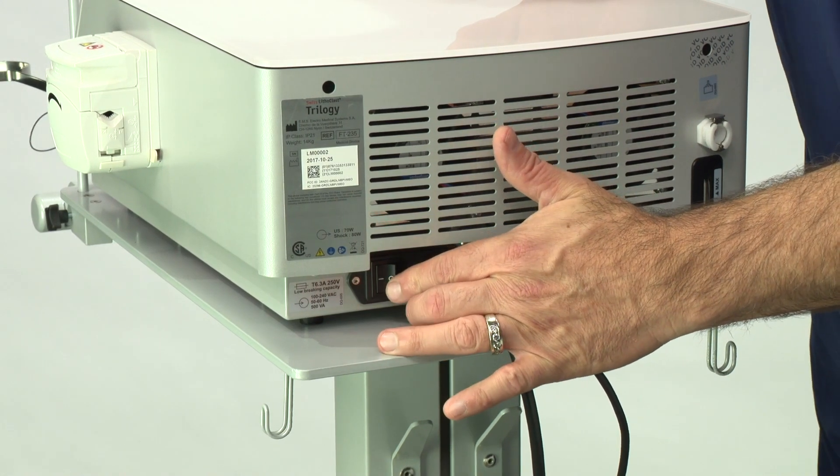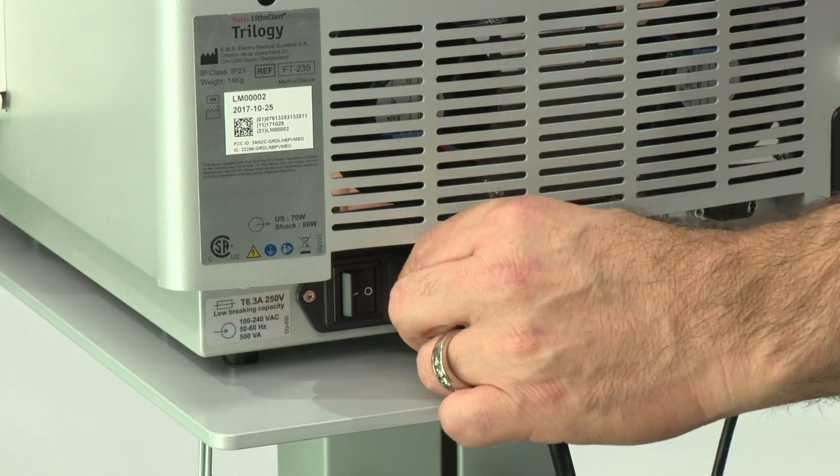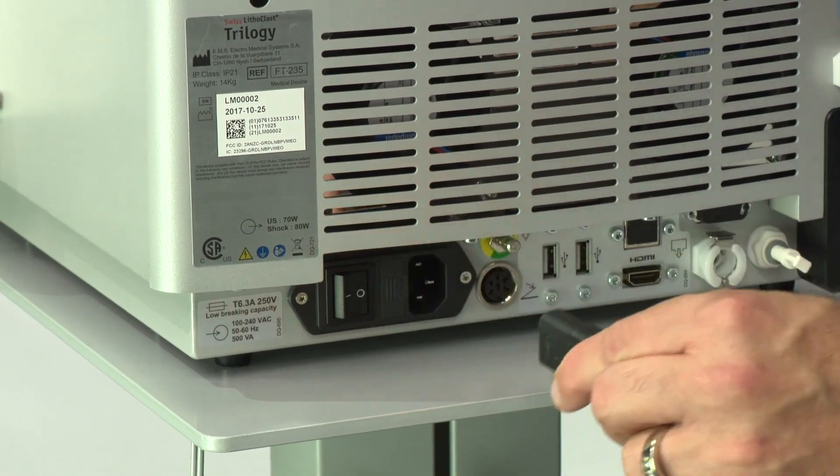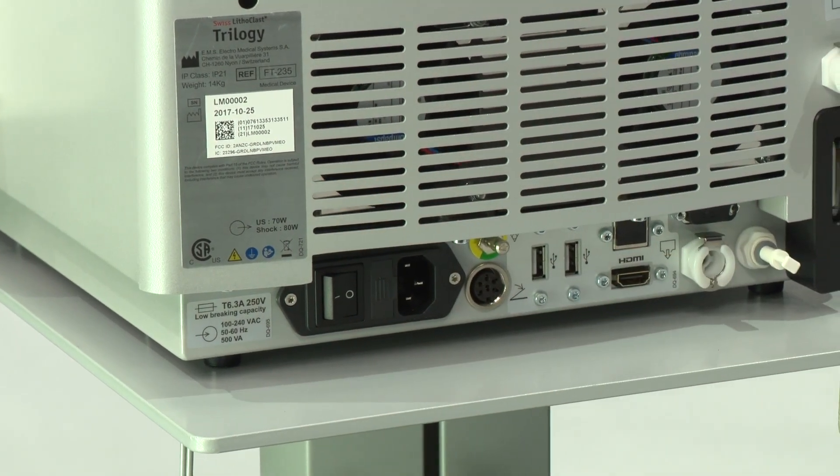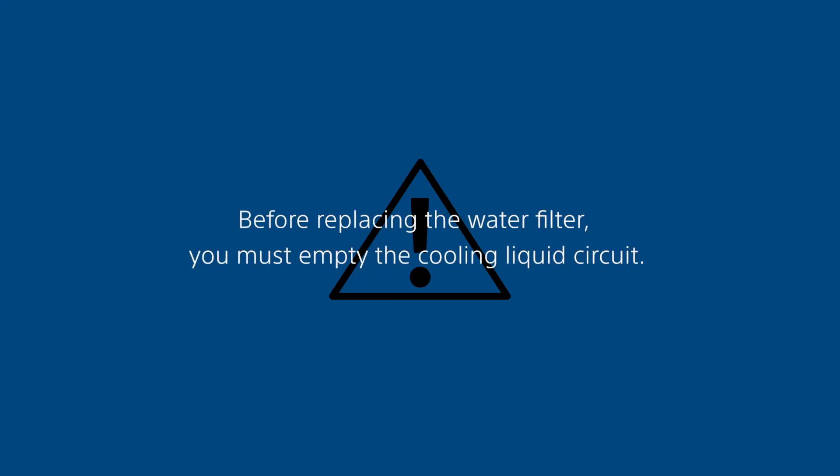For all maintenance operations, ensure that the unit is switched off and that the power cord at the rear of the unit is disconnected. The cooling liquid and the water filter should be replaced every year.